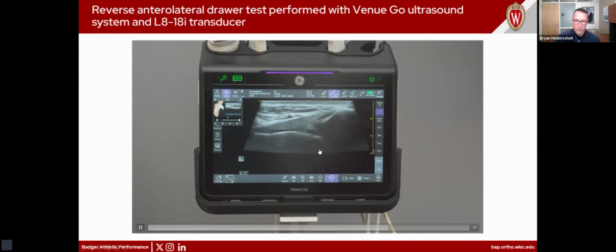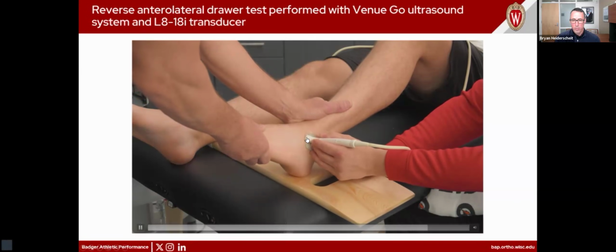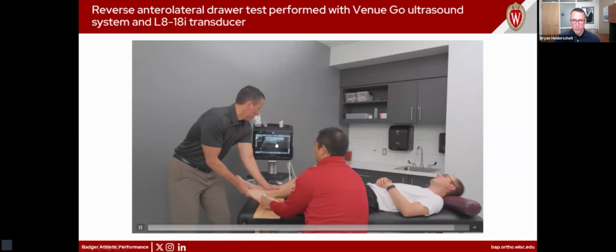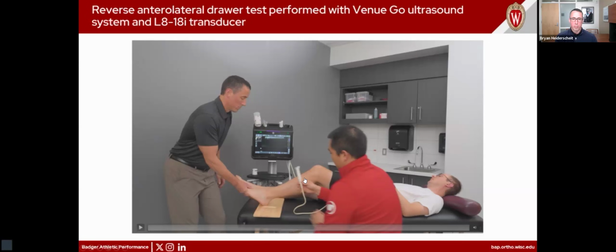And so you'll see it come up here on the screen pretty well. There's your lateral malleolus on the video, and your talus is located out by the toe region and showing up on the screen through that location. And then as it's pulled off and it's complete. So it's a fairly quick process. And again, the load sequence is that 3 seconds of preload, 3 seconds of actual loading and performing the reverse anterior drawer to its max displacement, 3 seconds of unloading.